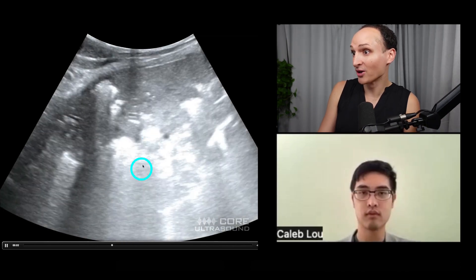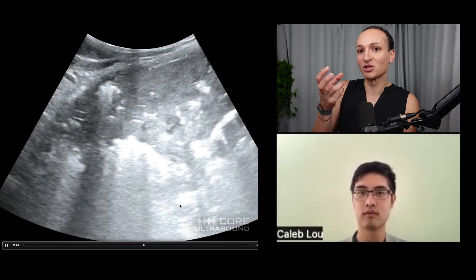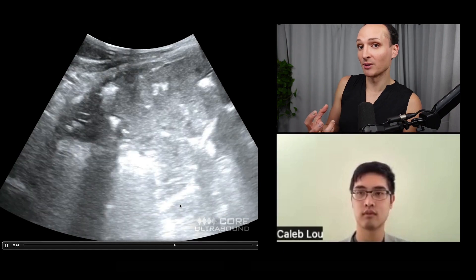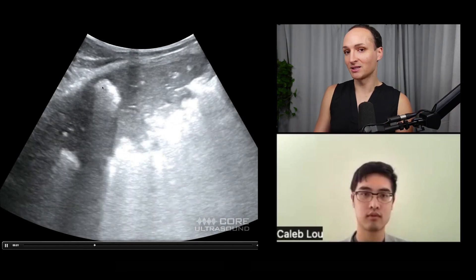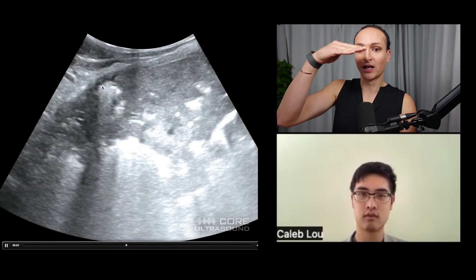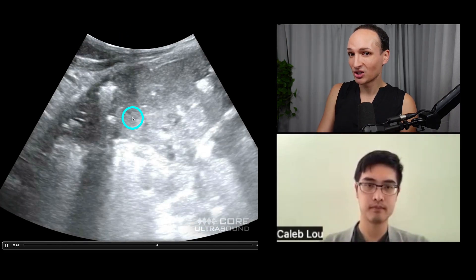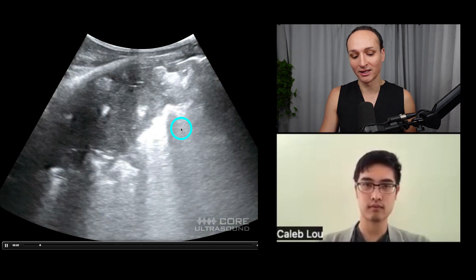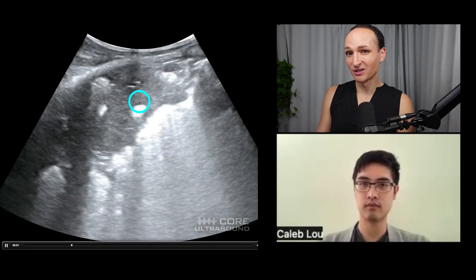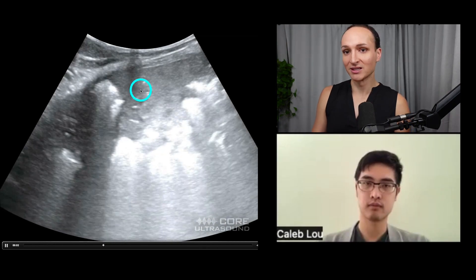We sometimes struggle more with identifying an abnormality than understanding what it means. On the contralateral side, we'd see rib, pleural line, and A-lines deep to it. But once you start to see actual lung tissue — which is what we're seeing here — that's always abnormal. You should never see lung tissue on ultrasound. Most of the time when you see this much consolidation, it's from pneumonia. It could theoretically be atelectasis — atelectasis is a compressed lung with less air and more tissue concentration — but usually not this bad.